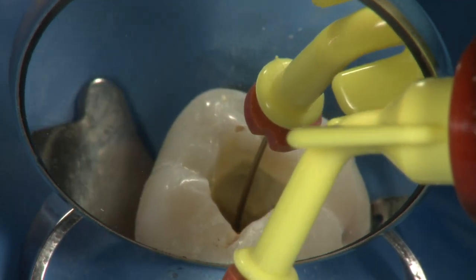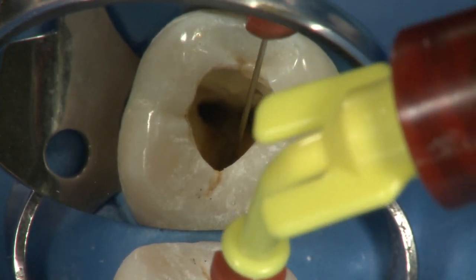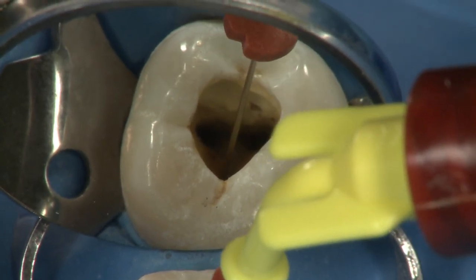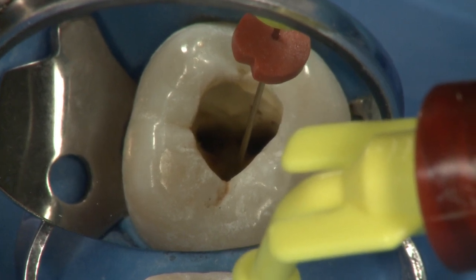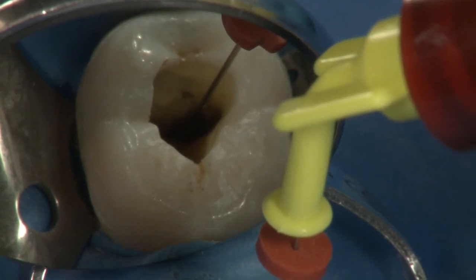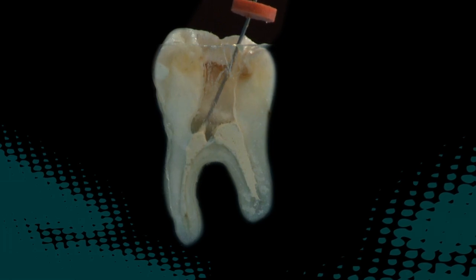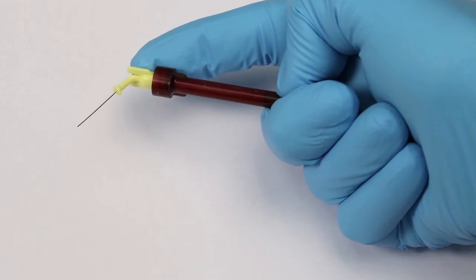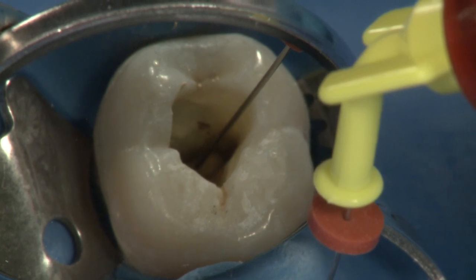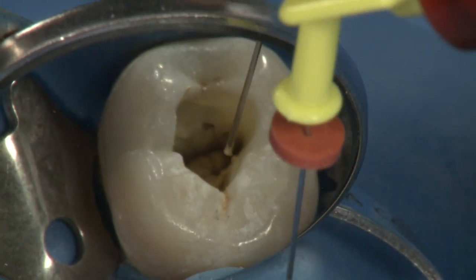Begin gently expressing EndoRes into the canal — do not force the material out. Keep the tip of the NaviTip buried in EndoRes as you backfill the canal to eliminate air bubbles or voids. Caution: do not deliver EndoRes if the NaviTip fit is tight, as doing so may express EndoRes beyond the apex. If EndoRes is not flowing up the canal around the NaviTip, stop and check if the tip is clogged. Do not use excessive force on the skinny syringe plunger. Stop filling the canal about 1 millimeter short of the canal orifice — there is no need to fill the pulp chamber with sealer.